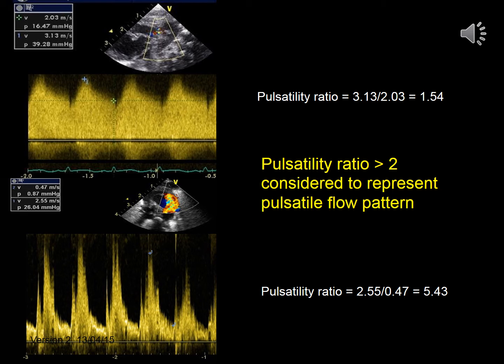The calculation of the pulsatility ratio is demonstrated. In the upper example, the peak velocity is 3.13 m/s and the minimum velocity is 2.03 m/s, giving a peak-to-end-diastolic ratio of only 1.54 — this is a closing PDA. In the lower example, the pulsatility ratio is 5.43, with a peak velocity of 2.55 m/s and end-diastolic velocity of 0.47 m/s. A pulse ratio of more than two represents a pulsatile flow pattern.